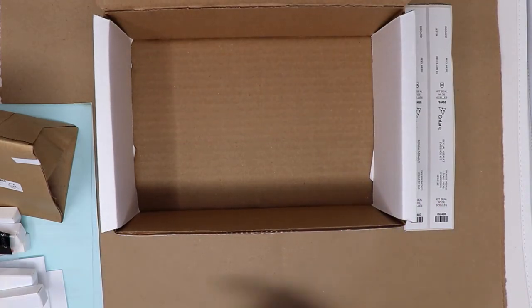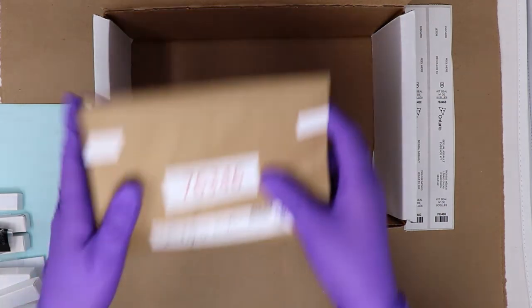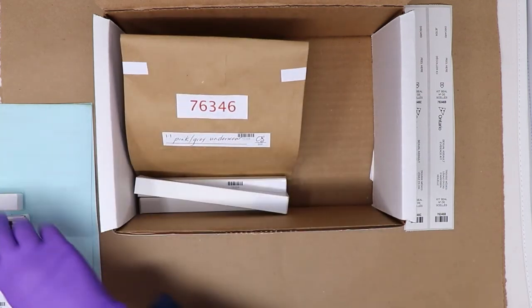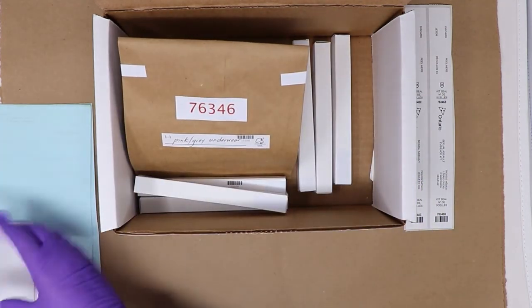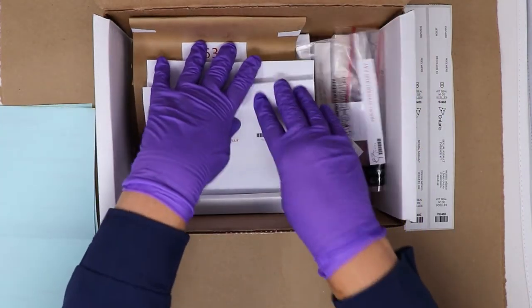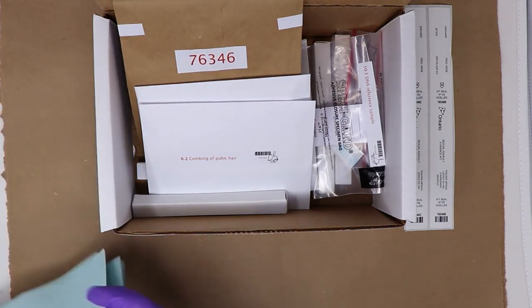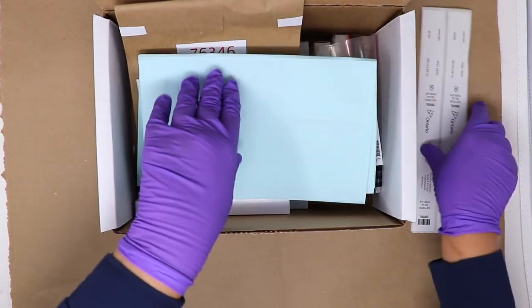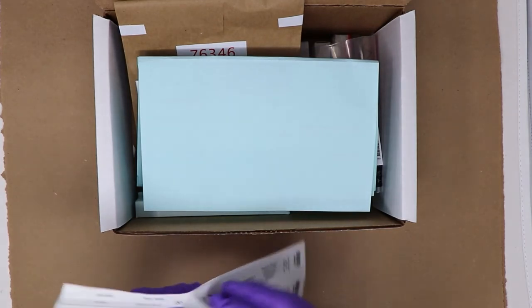Once all examinations and paperwork are complete, the evidence should be placed back inside of the core kit box. All evidence should be placed back into the box, ensuring that it is properly sealed and labeled. This includes any underwear or other clothing, swab boxes, and envelopes. The blue copies of the forensic evidence form will need to be separated and collated to also be included inside of the box. There are 2 additional seals provided with the kit.